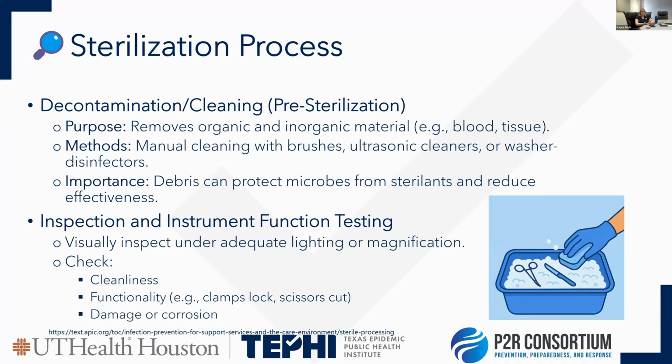Also during decontamination, when they're cleaning and setting up, there should be a visual inspection, making sure the equipment is looking right and there are no cracks. Depending on what they're working with, they're also doing leak tests and looking at the equipment itself.